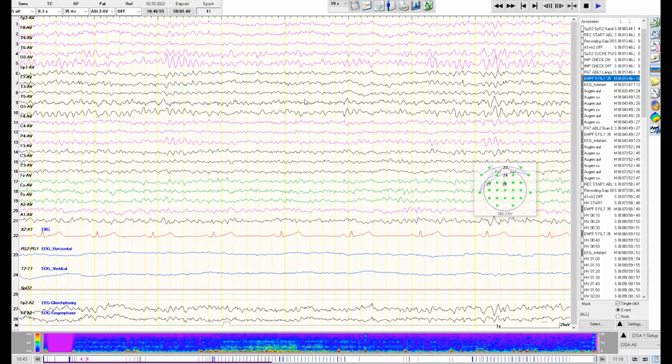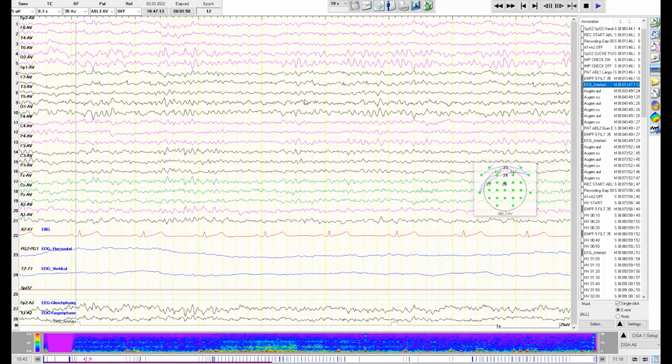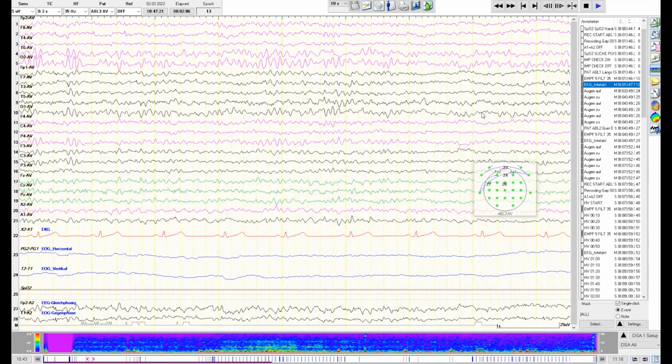So this is the basic rhythm as you look at an EEG. And as in the ECG you look at the heart rate, here you look at the basic rhythm for the brain, and we go through that. And we also try to check the notions that the assistants gave us. So here everything seems to be good. No epileptiform activity detected from them. However, we go through. We also check if the ECG down there is rhythmic or if there are any ventricular extrasystoles or anything else going on. It also looks like we have a P wave just for checking. And then we go through the EEG.